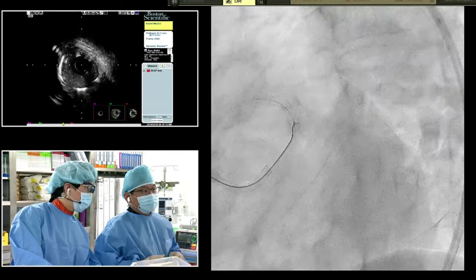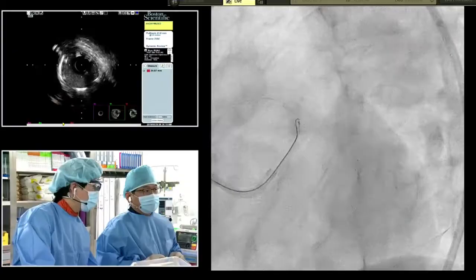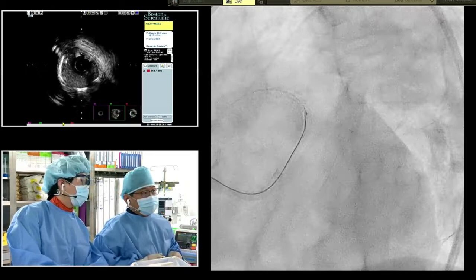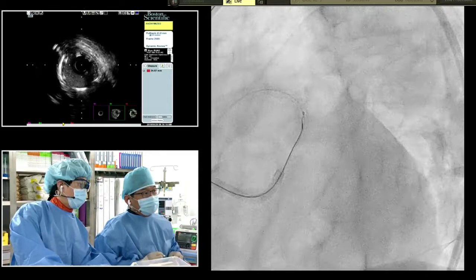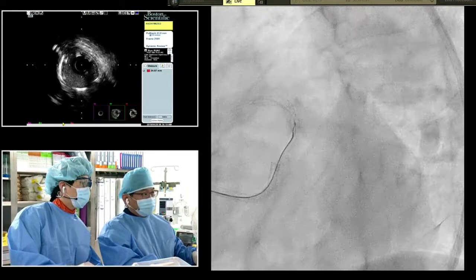I think the problem here is not just the reversed angulation, but also the diseased ostium. And yes, you must pass through the stent strut. I think all these add up together. That problem also, should we move to the stiffer wire? It's not easy, right? I think the stiffer wire will just make it so the wire cannot follow through because of the curve, even though you are in the true ostium. Yeah, you're right. Another problem is there is some bending at the left main.